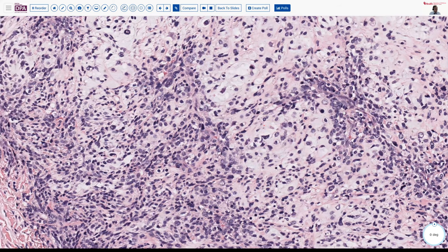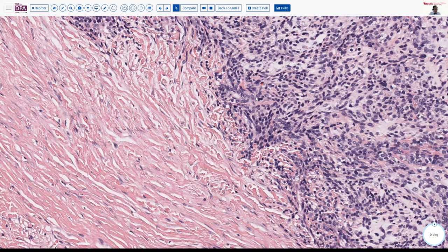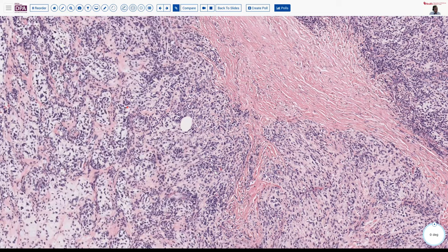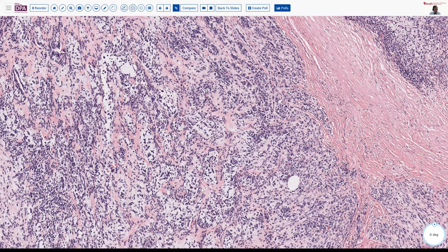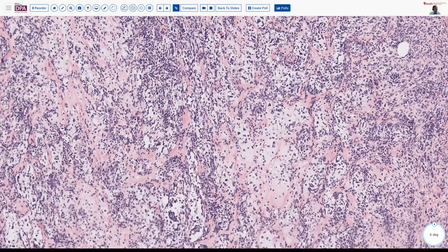So looking a little further, we can see that there is more of this tissue, and it has this sort of biphasic appearance. So tumors that can have biphasic appearance, we mentioned already dedifferentiated chondrosarcoma, but this doesn't have the clear-cut low-grade lesion. It's got the blastic appearance intimately associated with and surrounding the more chondroid areas like this. And so it's a biphasic appearance, but that's very much intermingled one with another.